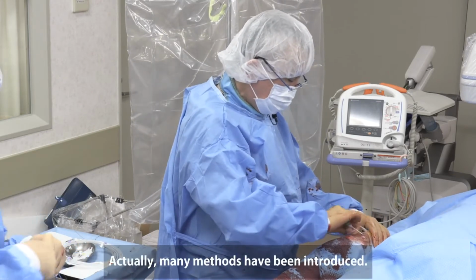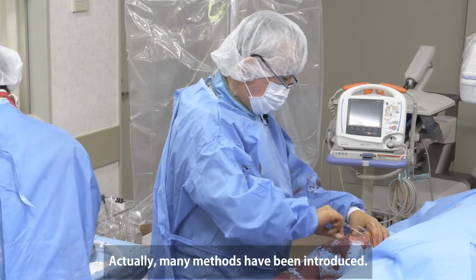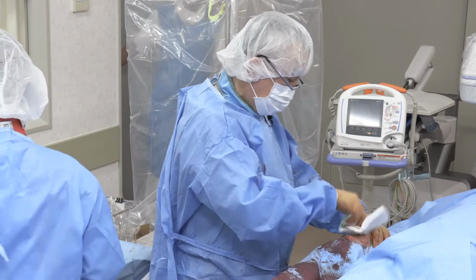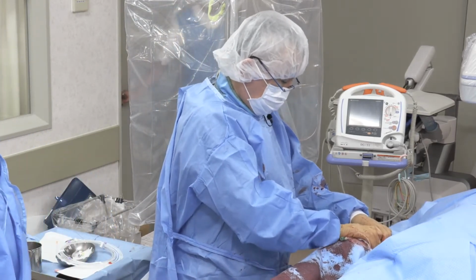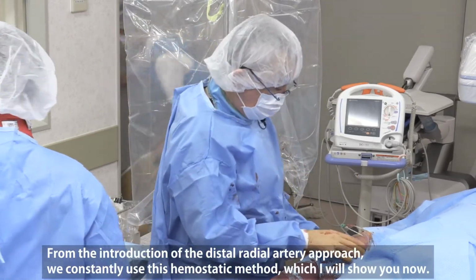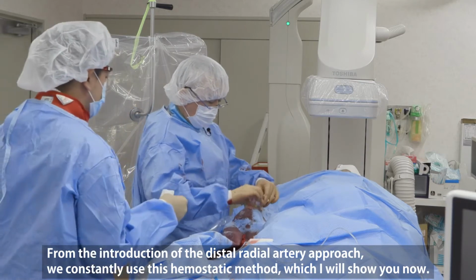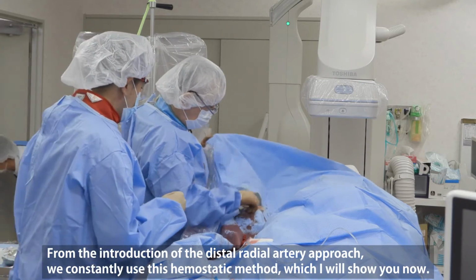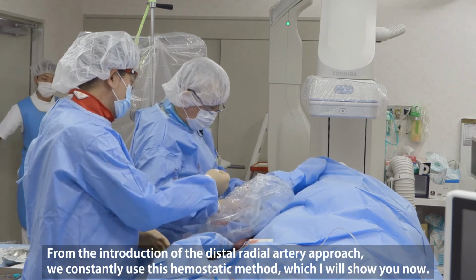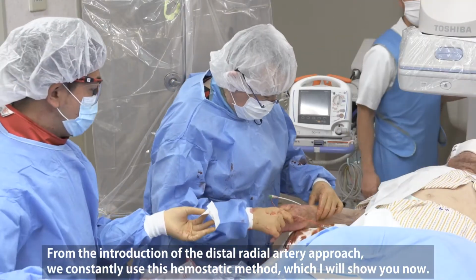Actually, there are many methods that have been introduced, but from the beginning of the introduction of the distal radial artery approach, we constantly use this hemostatic method, which I will show you now.